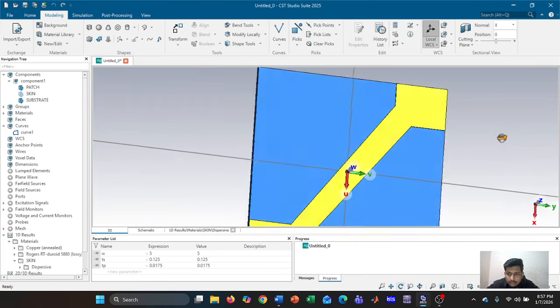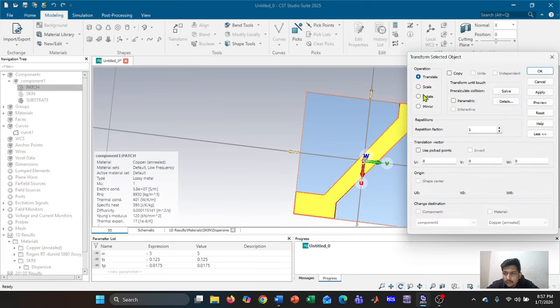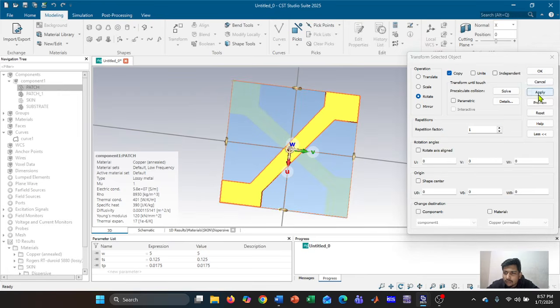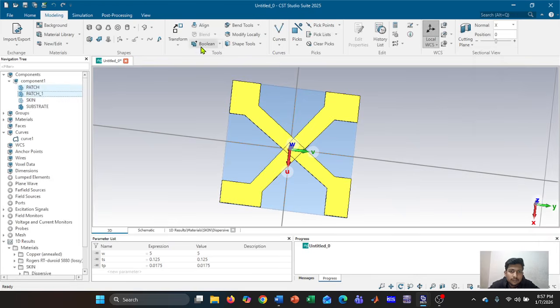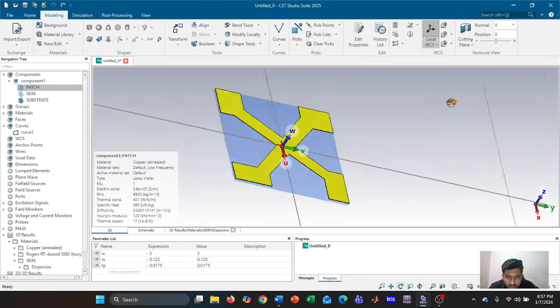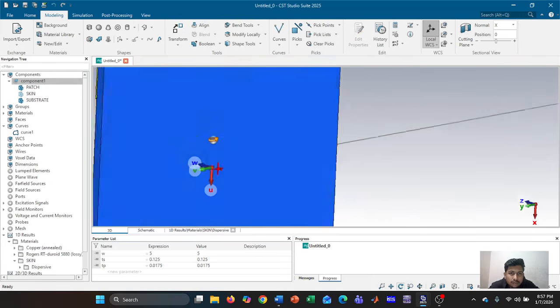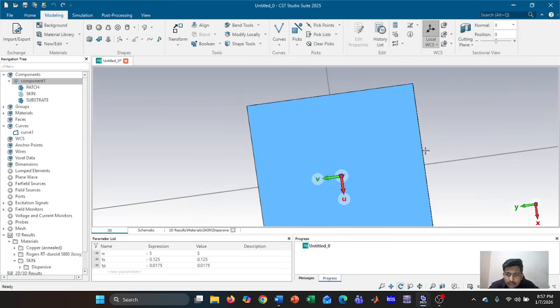As for the patch, you can select the patch, click transform, click rotate and copy. As I am going to make an X-shaped antenna, so copy it. Okay. So now I am going to add these two together. So this is the patch of my antenna, and now I need to design the ground patch. Previously I made the main patch and this is the ground patch.